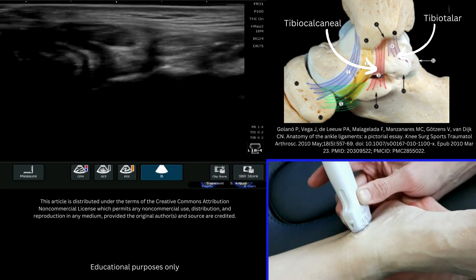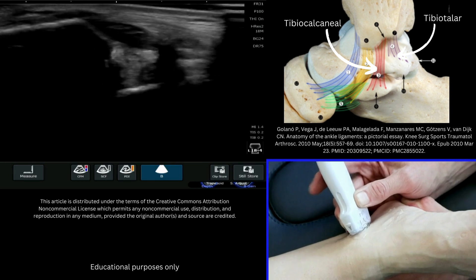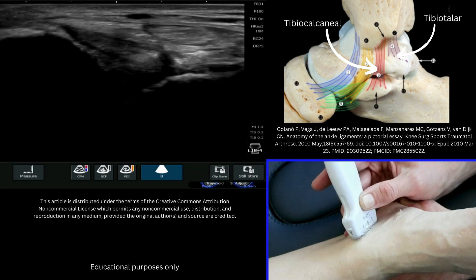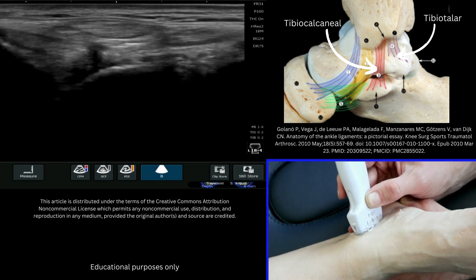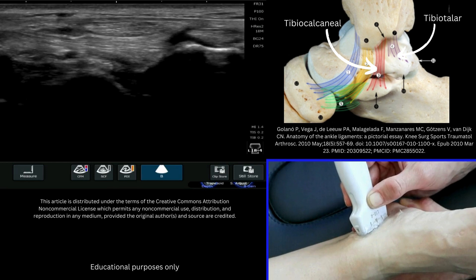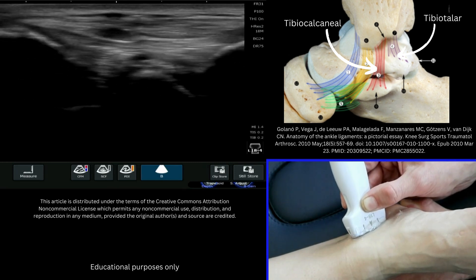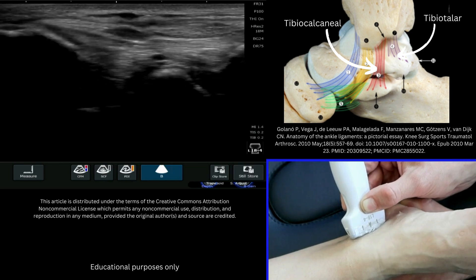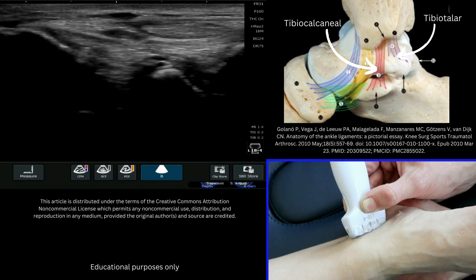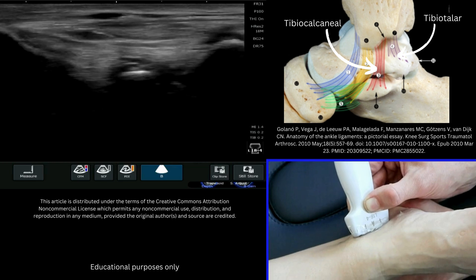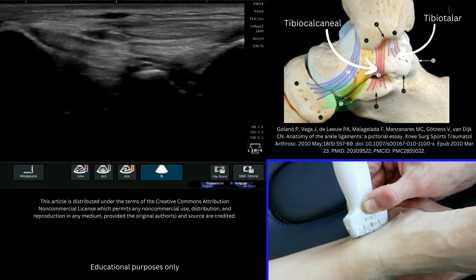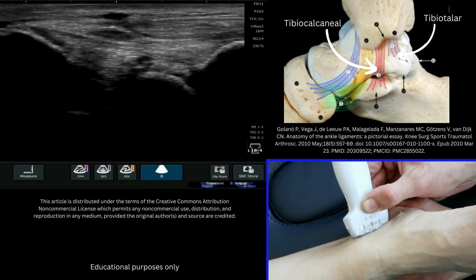We can also look at the tibiocalcaneal component of the deltoid ligament. Coming down, we find the medial malleolus and roll the probe slightly more inferior to find the sustentaculum tali, which is sitting just here on the right of the image. You're going to fishtail your probe and you'll be able to start to see the tibiocalcaneal component of the deltoid ligament — here very nicely stretching over the top of the deeper tibiotalar fibers, which sit a little bit deeper.